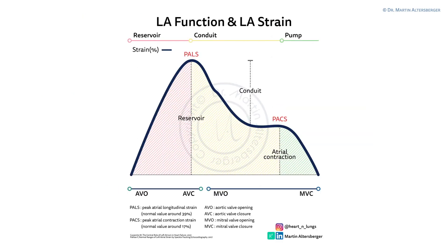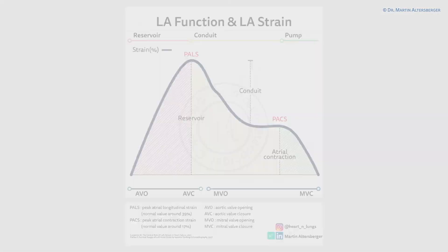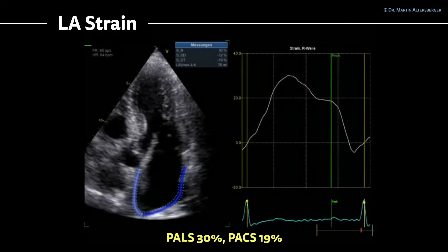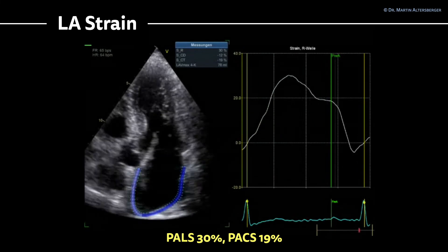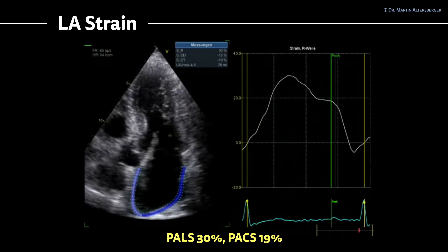As discussed previously, we can use left atrial strain and left atrial function. We look at two measurements: the PALS — peak atrial longitudinal strain — and the PACS — peak atrial contraction strain. Applying those measurements, the PALS at the tip of the curve is approximately 30%, which is reduced but points towards normal filling pressures. The PACS is 19%, which also points towards normal filling pressures.